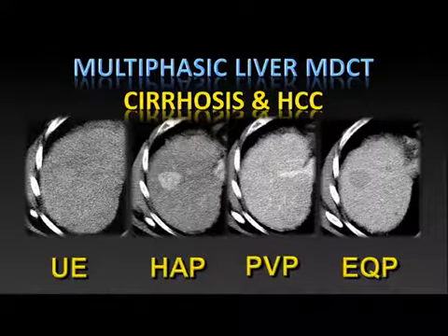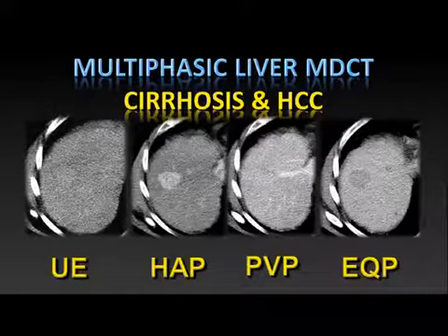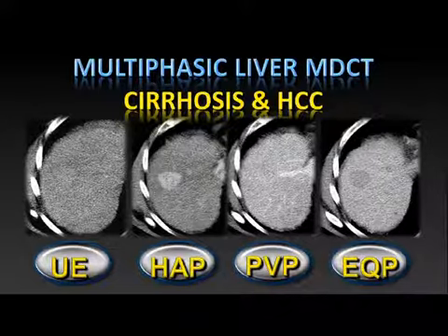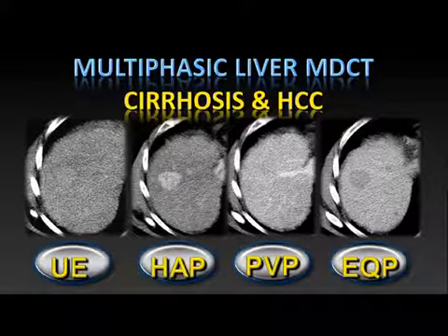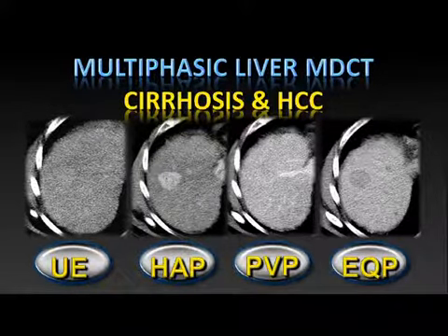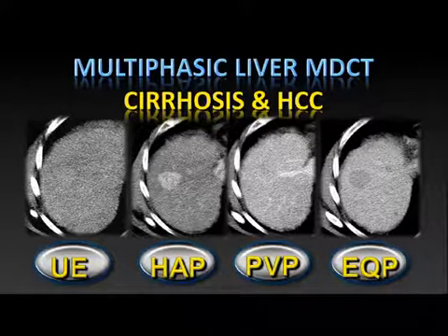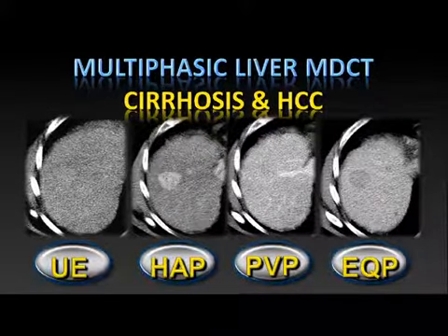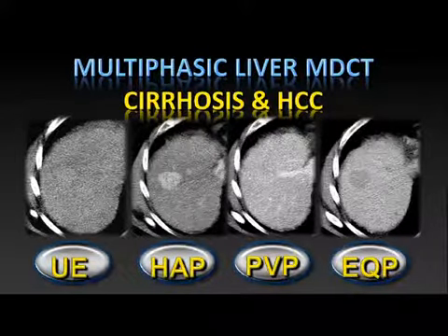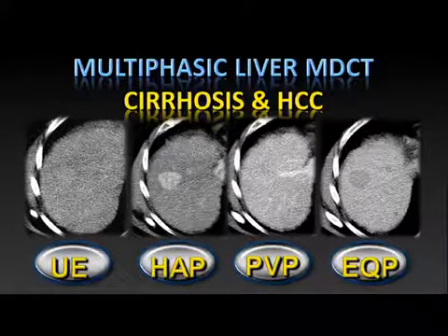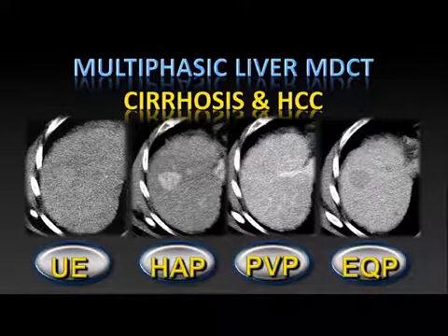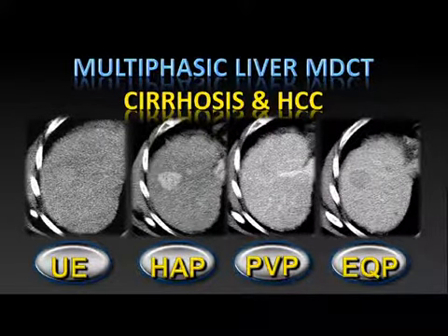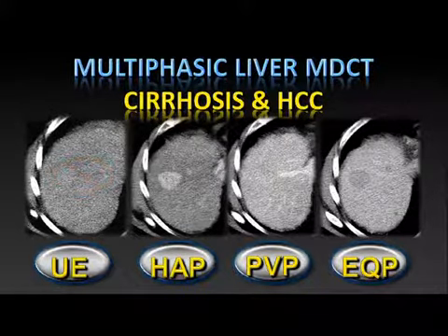Here is a case borrowed from Rendon Nelson showing the unenhanced phase, arterial phase, portal venous phase, and equilibrium phase. There's an enhancing hepatocellular carcinoma — classic for that disease. You don't see it on the pre-contrast scan and don't really appreciate it on the portal venous phase. You see it nicely on the delayed equilibrium scan, with two other lesions uniquely identified there. The point is we need to be very careful about choosing the appropriate number of phases. It's ironic that perhaps the single best phase for HCC is an old five- to seven-minute delayed scan.